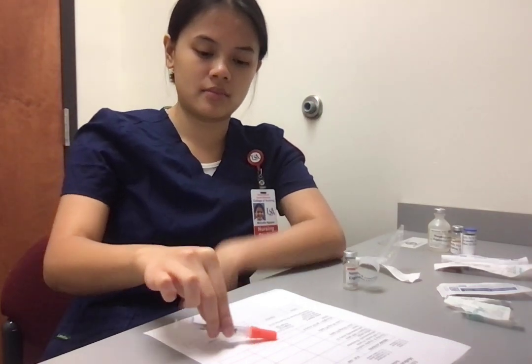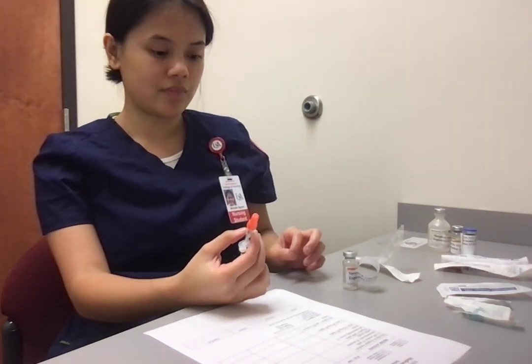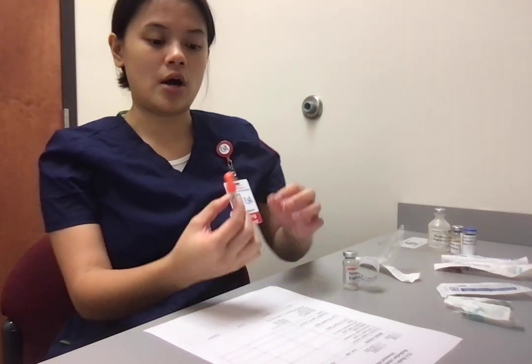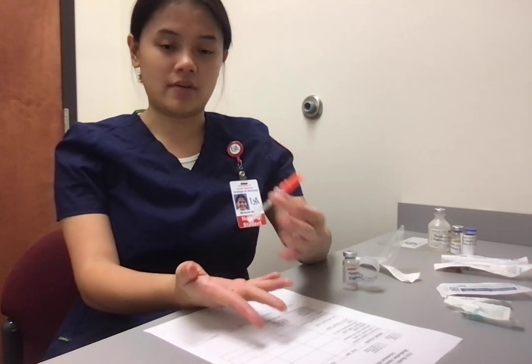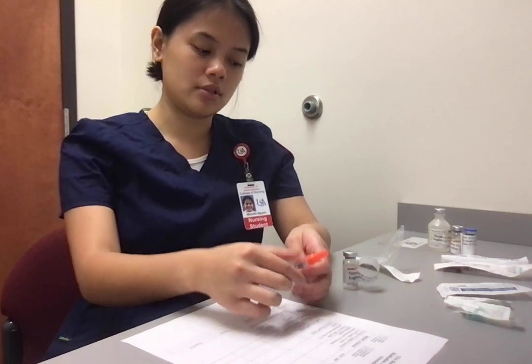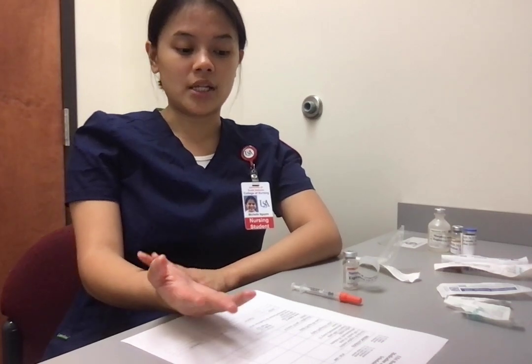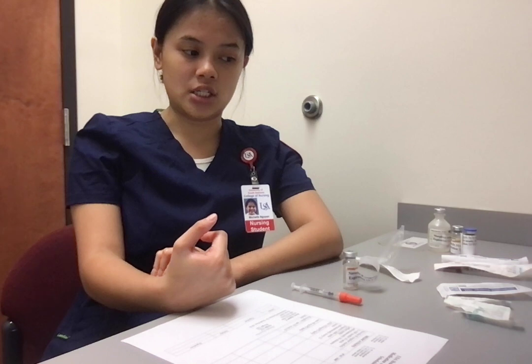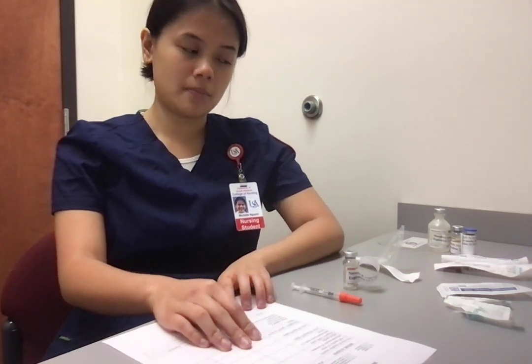Now I'm going to recap my needle using the scoop method. So now I would also ask another nurse to verify my medication if necessary. So for right time, 30 minutes before meals. Right indication, make sure that the blood sugar levels are regulated, and then my right documentation, all legal prescriptions are included.